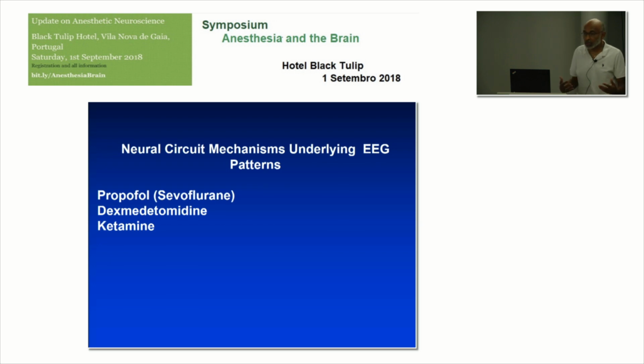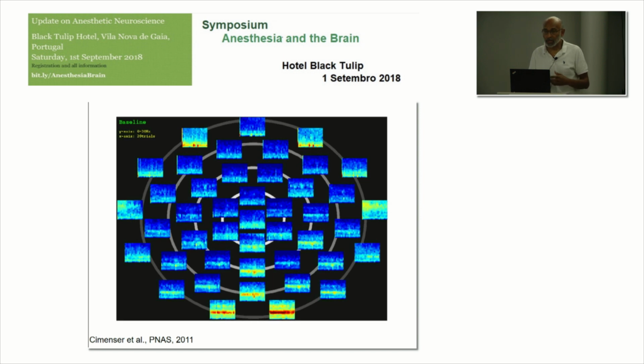And I think in our own literature, we have an explanation for that, which has been around for years, but I think we just haven't appreciated it. So this goes back to 1977. John Michenfelder and John Tinker at the Mayo Clinic did these studies in monkeys in which they gave them isoflurane. One of the things they noticed was that with whole-head EEG on, the alpha oscillations, the 10 hertz oscillations, moved from the back of the head to the front. And they called this anteriorization.